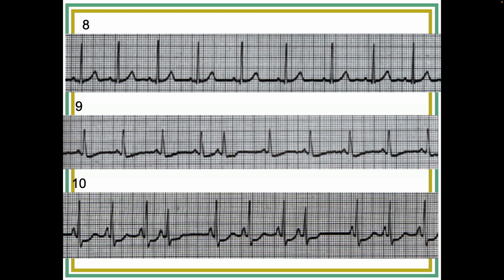I got the same ones. But the truth is that I'm still going to go with this. If you call it sinus arrhythmia, that's great. But I think it's not fair to call it a sinus arrhythmia if I'm only giving you 6 seconds. So I'm putting this up here as a normal sinus rhythm. I'm persuaded it's a sinus arrhythmia, not because the difference is significant. 3 small boxes is not, it's the fact that there seems to be a pattern to it.